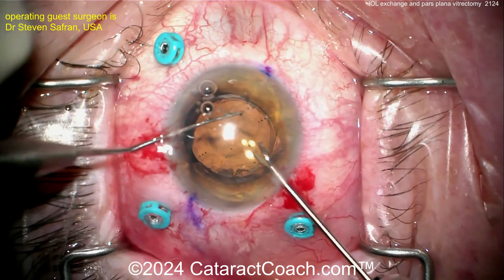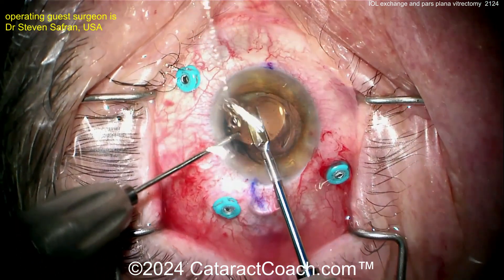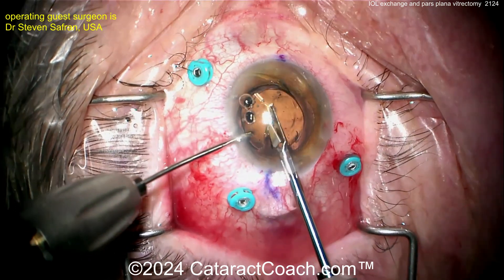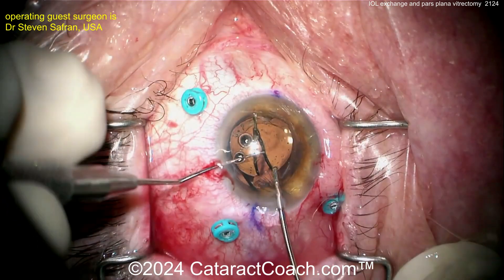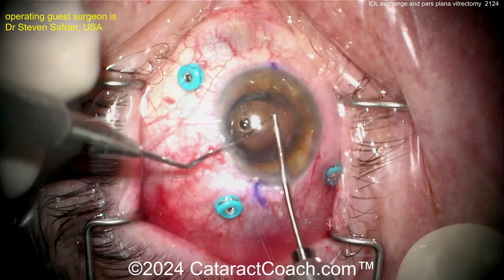Now to remove this, I would do my twist-and-out technique — you've seen that published here on CataractCoach — but Dr. Safford is going to use these micro scissors, and whatever works for you. He's cutting that lens, and you can actually just cut it 90% of the way through. You don't have to go all the way through, because then the pieces are still connected — you can pull out one half and the other half will just follow. That's another neat trick.